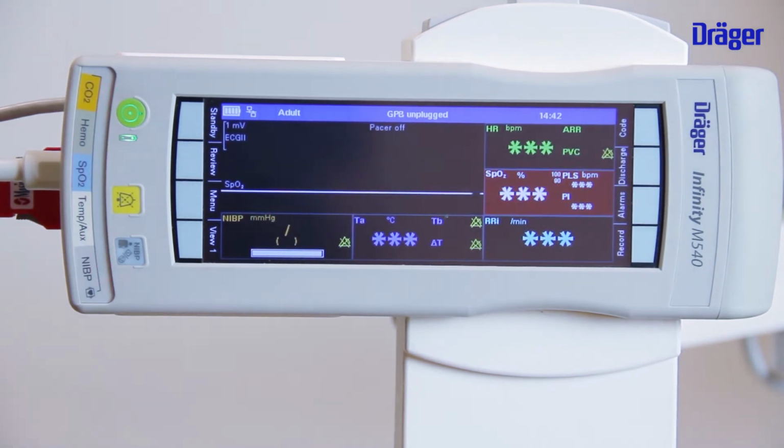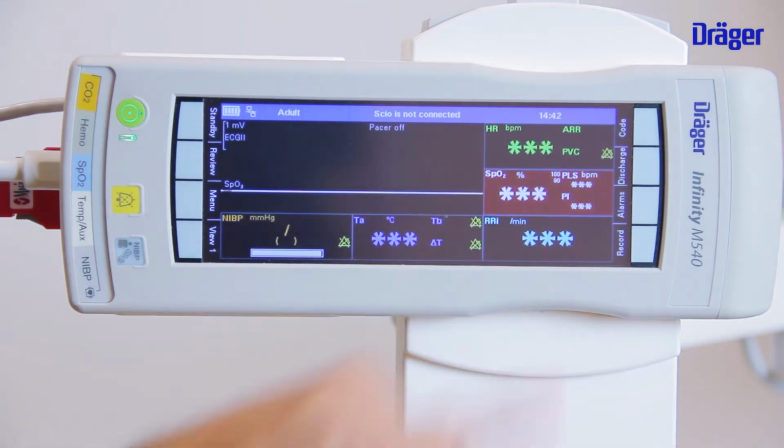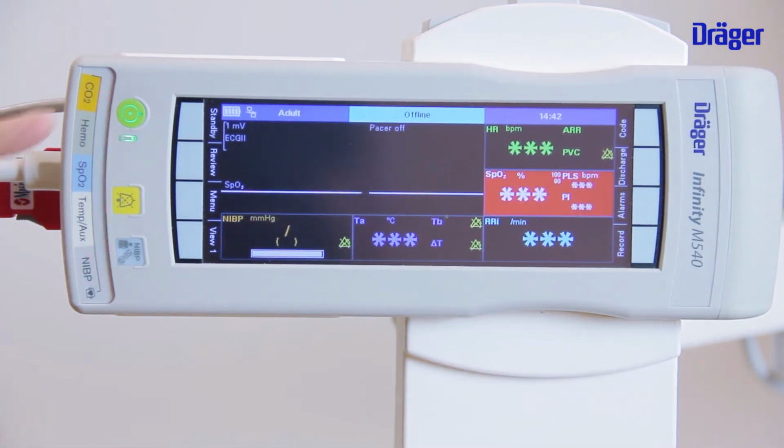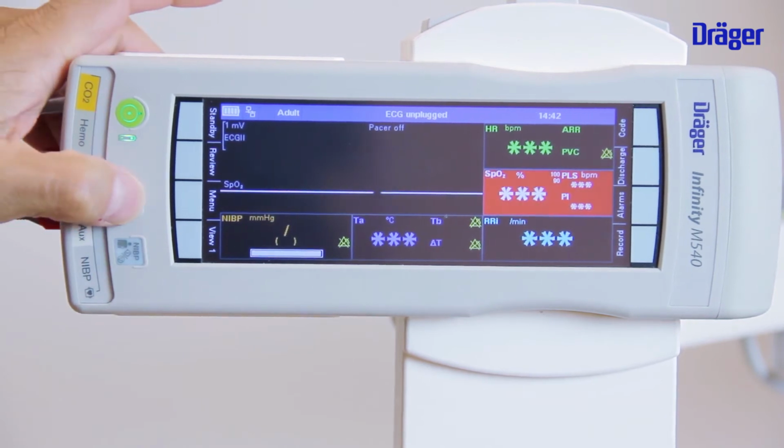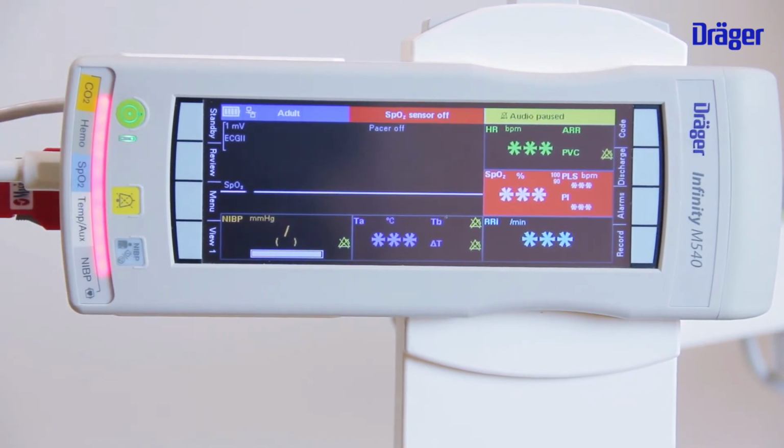This is a red or life-threatening alarm. First you will see the parameter box will light up, and then you see the alarm bar over here, which will light up in red. You can suppress or pause the alarm by pushing the alarm button. This will have a duration of 2 minutes.